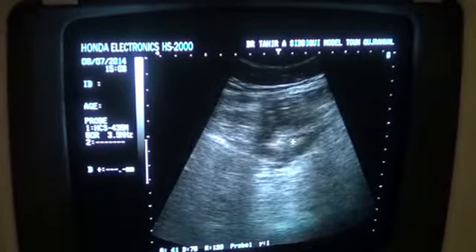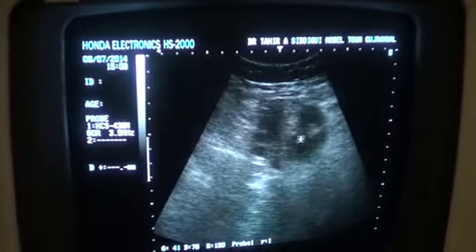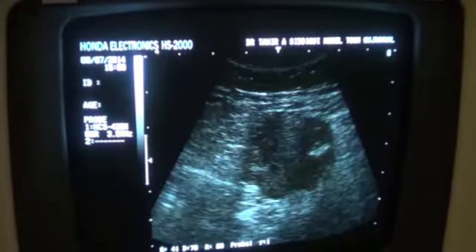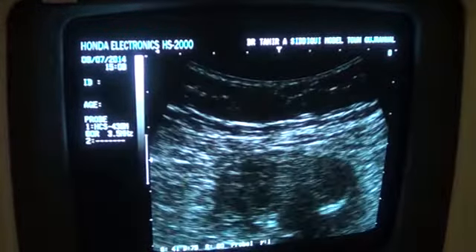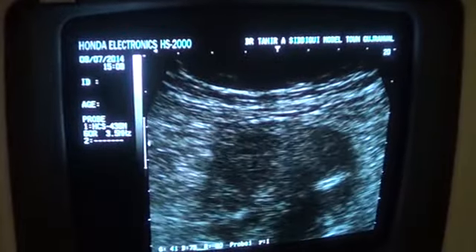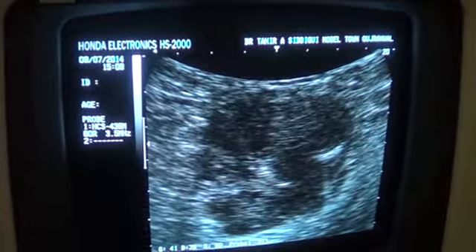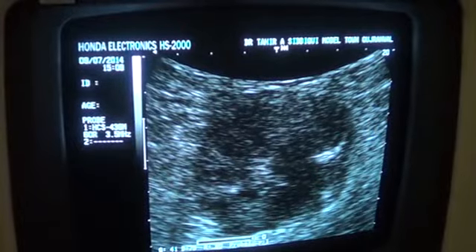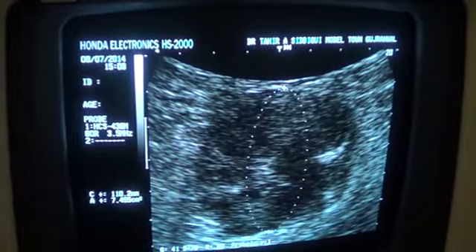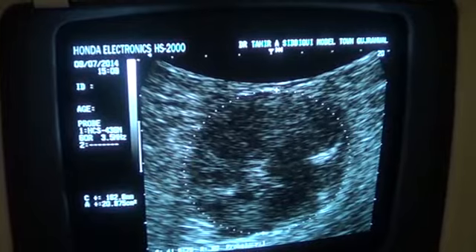This is the mass, and this is the peritoneal lining. So the peritoneal line is not being disrupted by this solid mass. The walls are blurred. See, I am focusing only on the area of interest, that is the mass. It's hard on palpation. I doubt anyone has even palpated it.